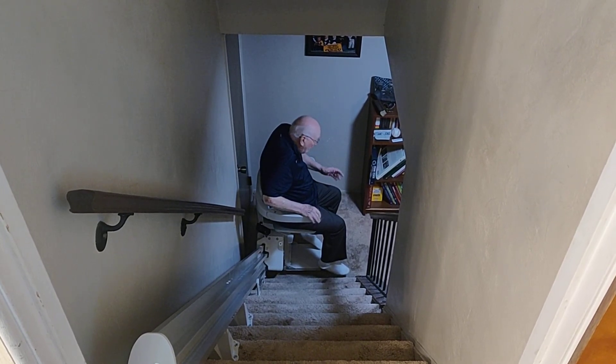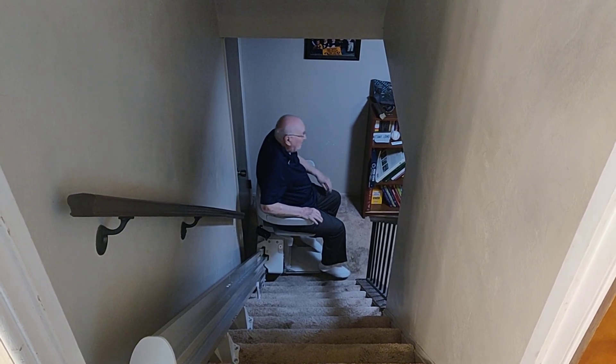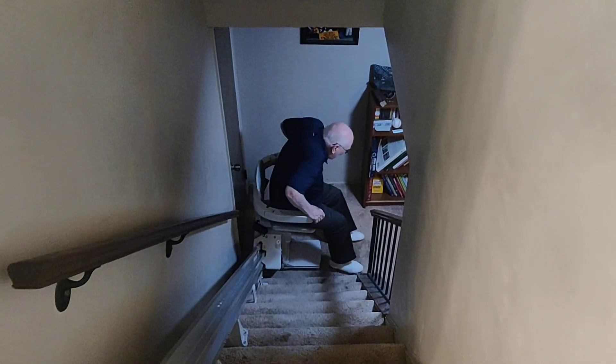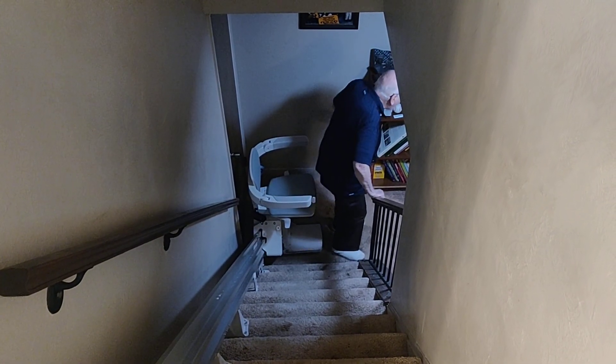A little bit more, a little bit more. That's it, that's it. So if I'm coming down here to use the bathroom, it's that much.